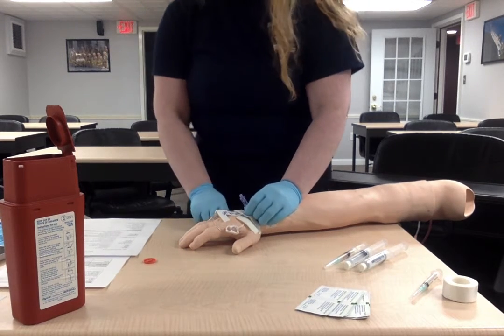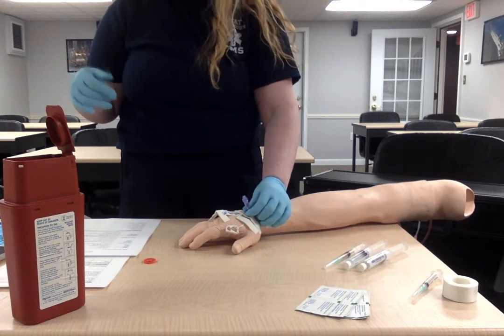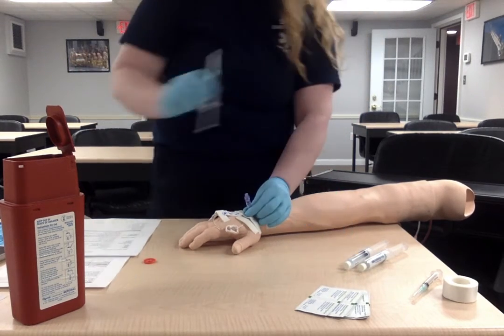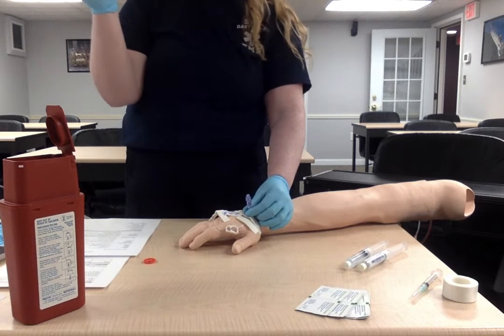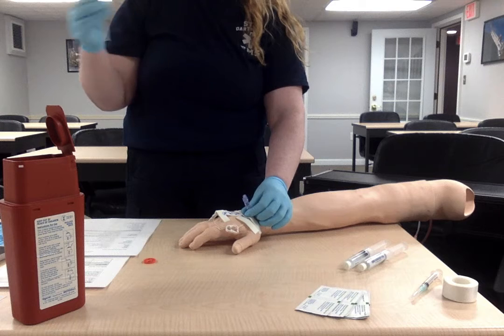We're going to let this dry. So now that it's air drying, you don't want to wave or anything like that. We're going to take our medication. So again, we know the dose of this is correct. We're going to double check this, make sure it's the 2 mLs, because each 1 ml is 0.25 milligrams.